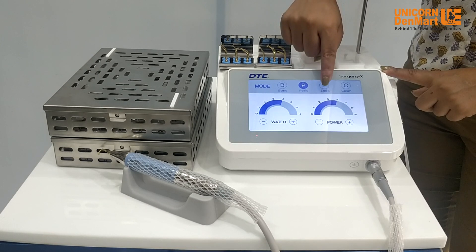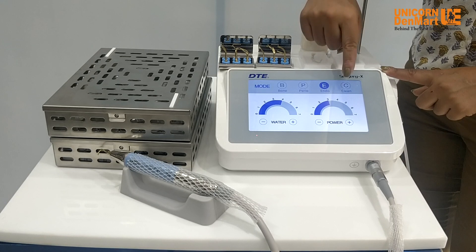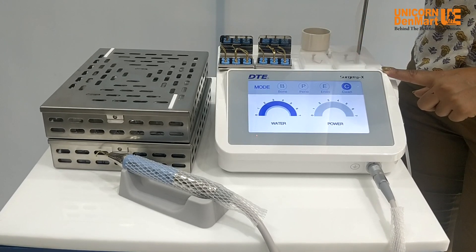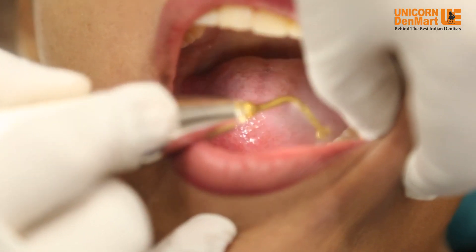Endodontic mode is used for retrograde endodontics. Cleaning mode disinfects the handpiece tubings before and after every patient, preventing cross-contamination.